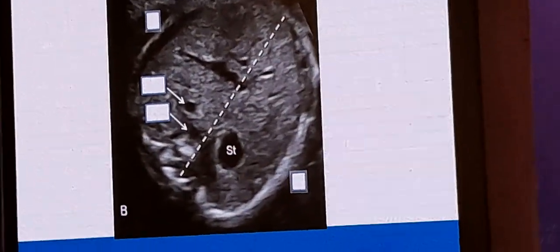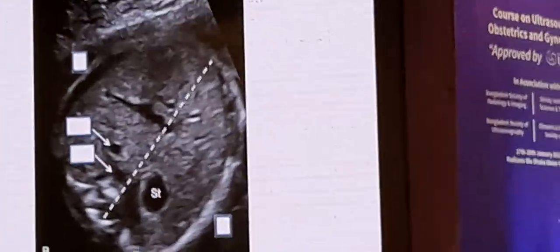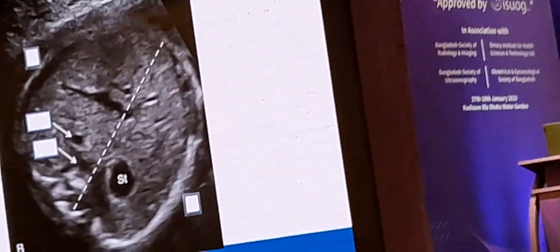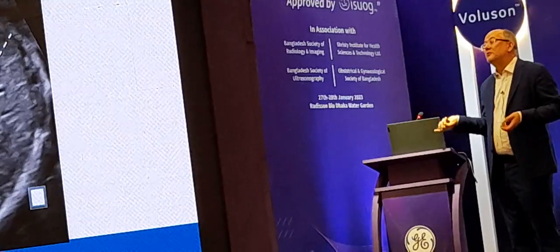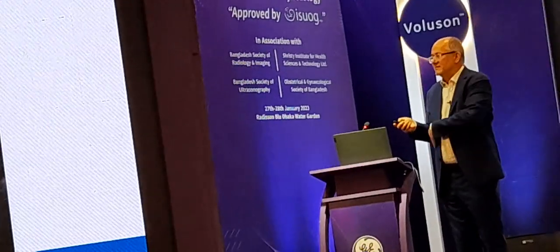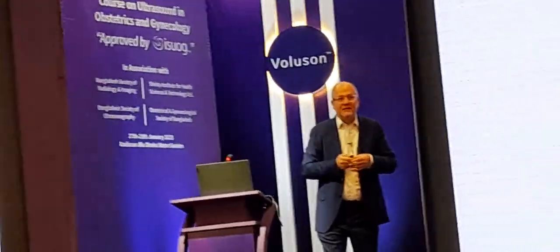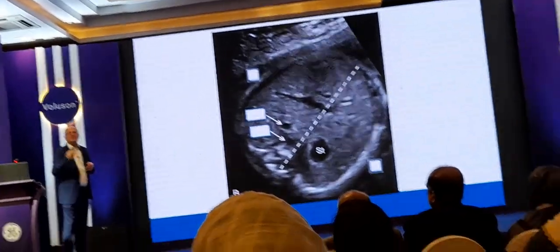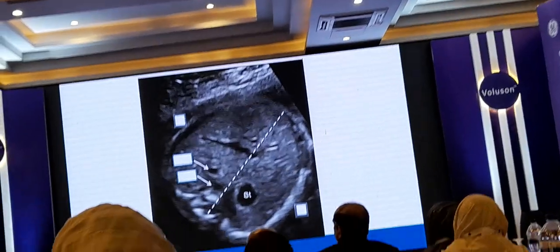Right. Now, Chair, what's the time? We have a live scan, we have a coffee break, and we have some pictures that we could go through or not. How much time do we have? We want to go through it. We should proceed with the live scan? Yes. Let's do the live scan. But because we can have tea at the same time as the live scan, we'll look at 3 of them.